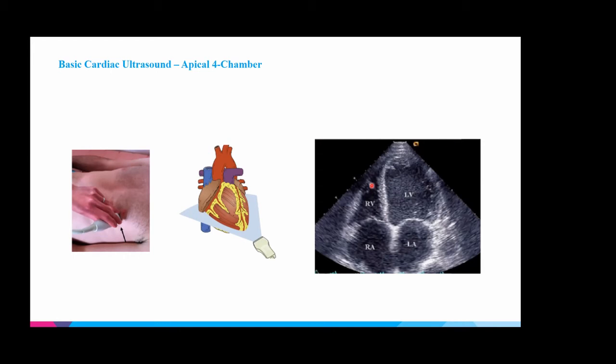And then if you were to look for something like endocarditis, I know the talk before me mentioned something about endocarditis, if you're looking at the tricuspid valve or mitral valve, this would be another location where you could see a vegetation. You could add color to look for regurgitation. But that would be as you guys get more comfortable getting these views.